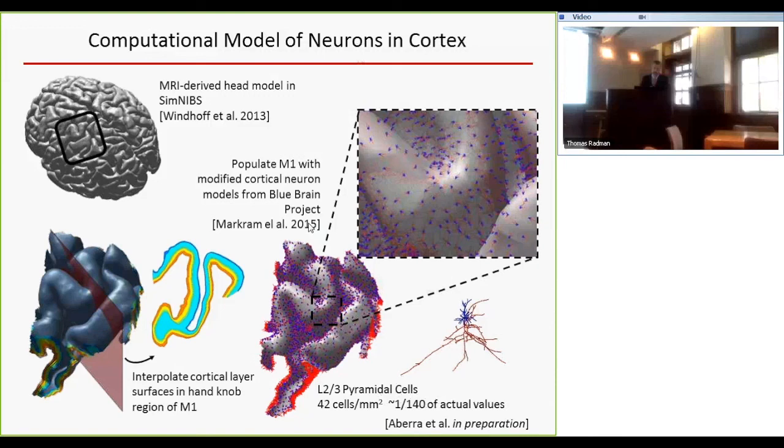And these particular areas are the areas that control your finger, the FDI muscle that's recorded here. So you can see that when you reverse the direction, you go from posterior-anterior to anterior-posterior, the activation in the crown remains by and large approximately the same. But you have a dramatic change in the activation in the wall of the gyrus. So that's a very notable difference when you change the direction. The field distribution is exactly the same. You're just changing the direction of the field. And that does not happen with the other pulses, which are more bidirectional, right? You see that, yes, there is a bit of a change, but you don't have this dramatic effect anywhere else.